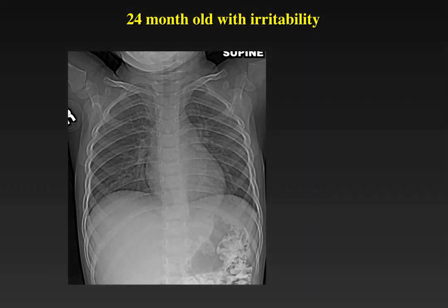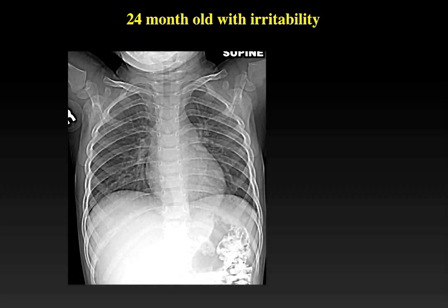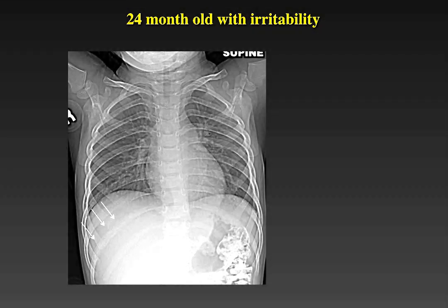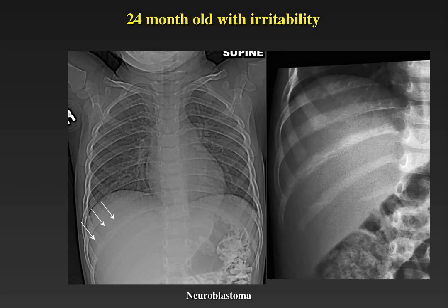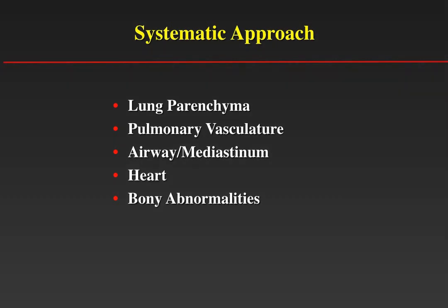Here is another two-year-old who presents with irritability. On initial inspection, the heart, mediastinum, lungs, and overlying ribs look normal. But if we focus on the right 10th rib, its density is different from the surrounding ribs. On a more focused view, it has a moth-eaten appearance with patchy areas of lucency and density because it is being eroded and invaded by a neuroblastoma.